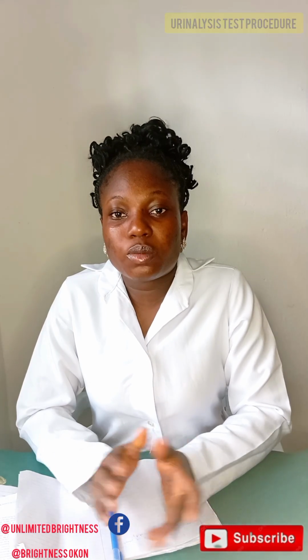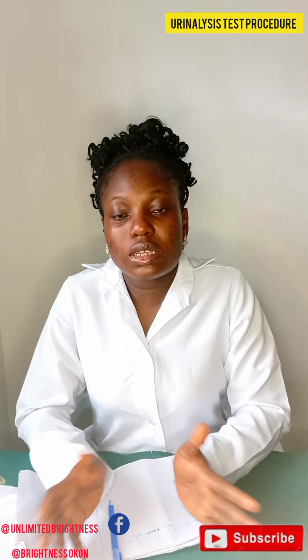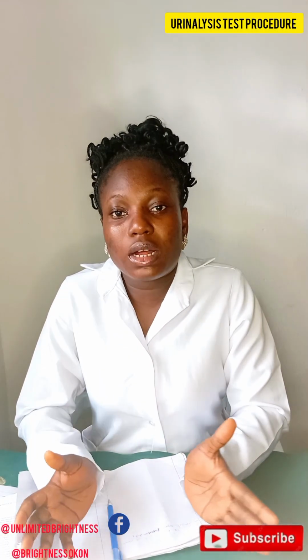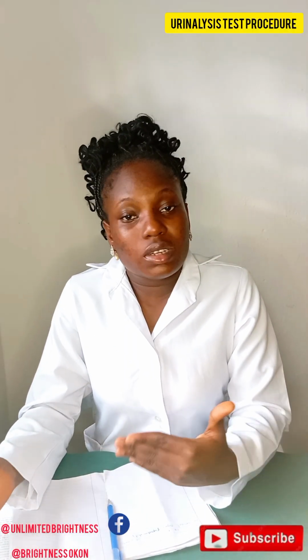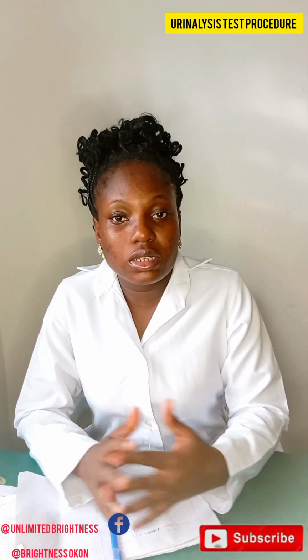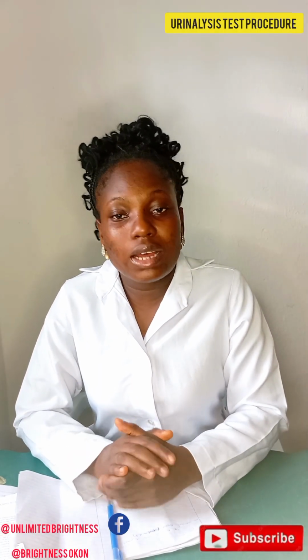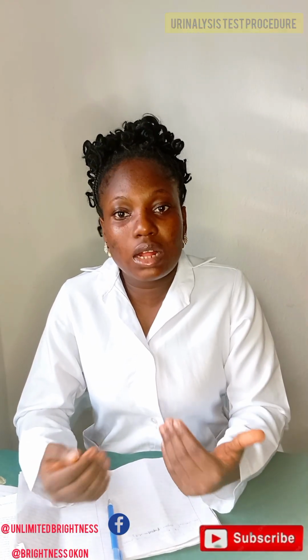So in today's video, I'm going to talk about urine chemical analysis, which is sometimes called urinalysis. It is a test that is done to detect and monitor our internal organs' functionality and the abnormal and normal constituents in urine, which is a function of the functionality of our internal organs. What I mean by this is the appearance of our urine can determine how poorly or how well our internal organs are doing their work.